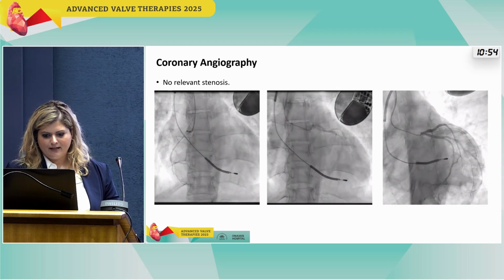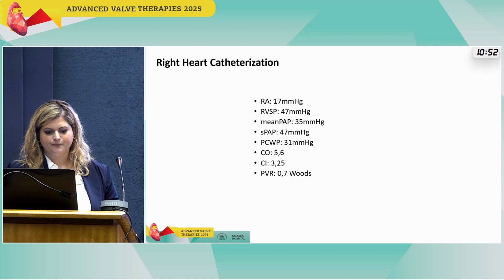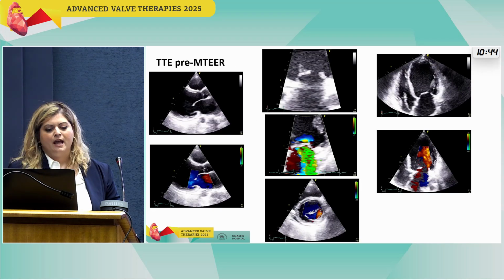We did perform a right heart catheterization, where she has a pulmonary hypertension of 47 millimeters Hg.